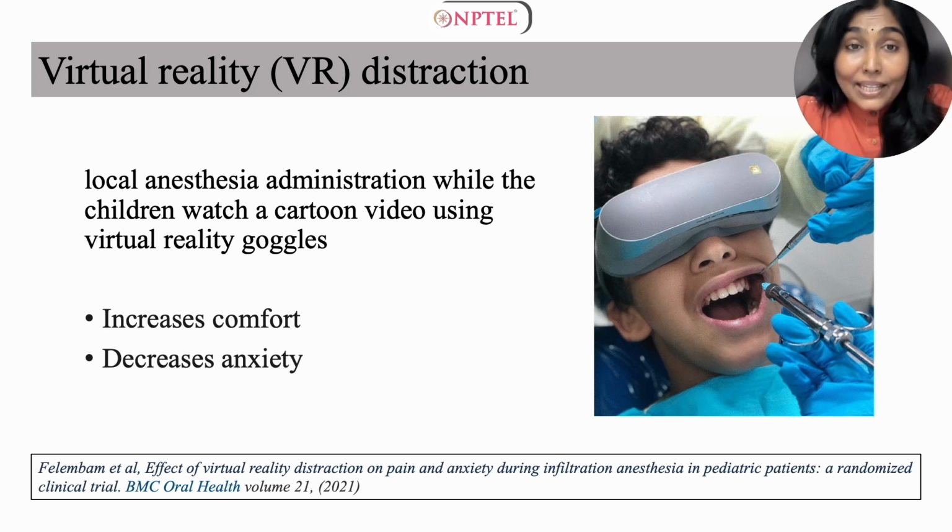Now, this has the aim of aiding in patient behavior management. It offers the advantage of immersive virtual experience, which blocks out all the external stimuli that may provoke a negative attitude. Distraction using virtual reality provides favorable outcomes for pediatric patients during anesthesia, such as increased comfort and decrease in anxiety.